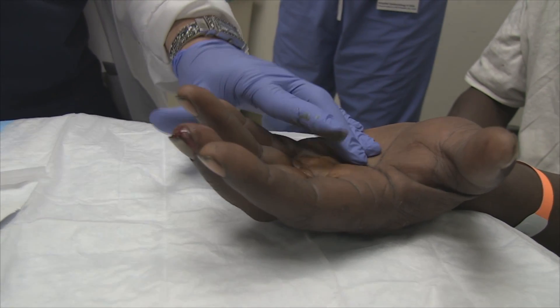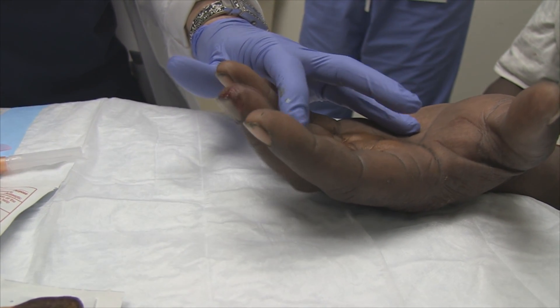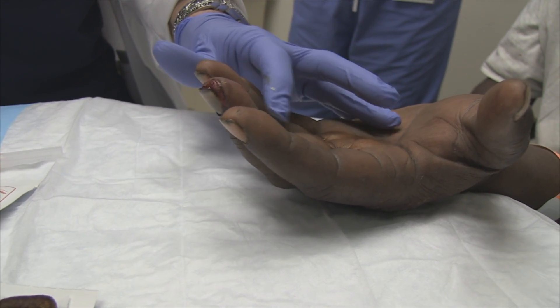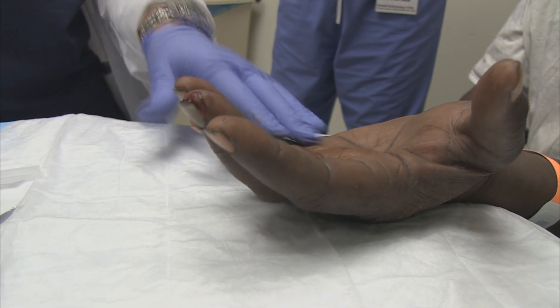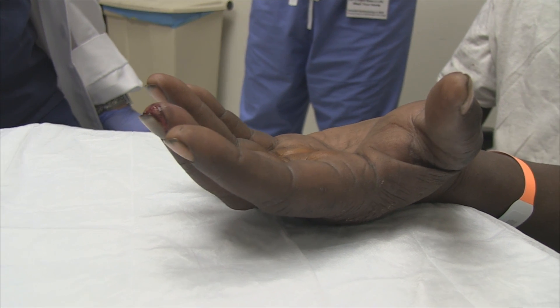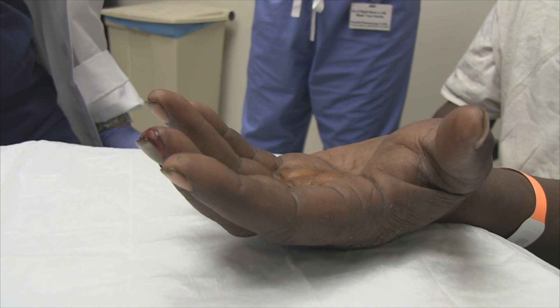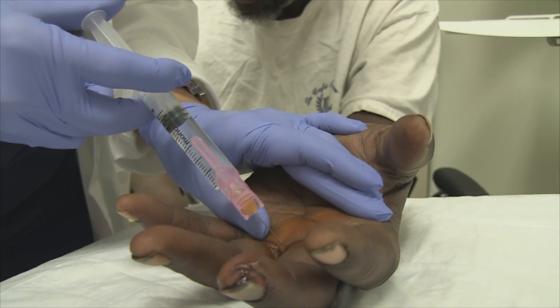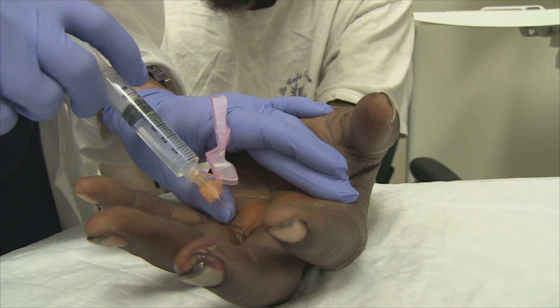It's been about a minute, two minutes, and you're starting to feel some numbness already? Yes sir. The metacarpal block wasn't exactly as successful — he still had pain, so he's getting a digital block now.